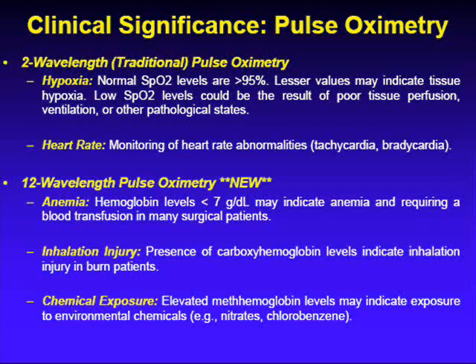Heart rate also is possible for monitoring with pulse oximetry. It allows you to determine if the patient's tachycardic or bradycardic, having a high heart rate or low heart rate respectively.